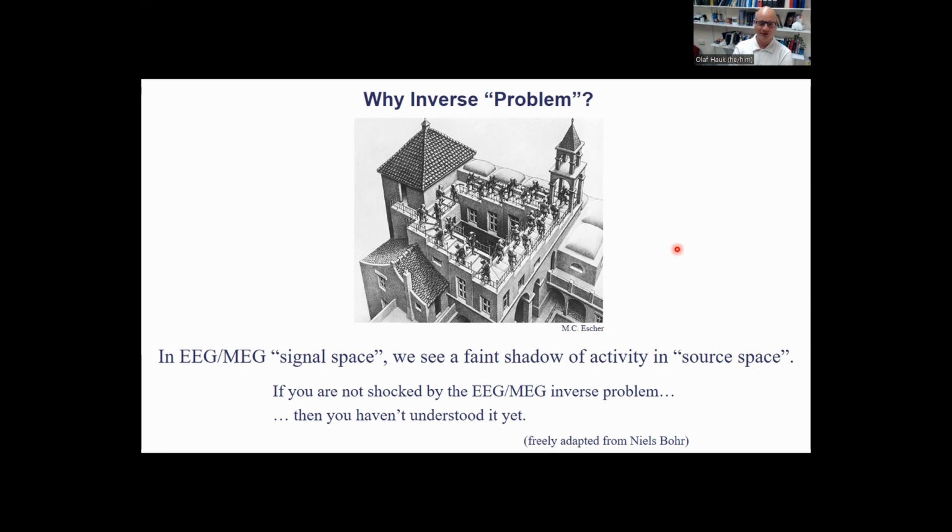Especially when you are starting to explore the zoo of different source estimation methods, there are simply some fundamental limits to our spatial resolution, to the information we can get from our data. And you either have to live with it or you have to find a way to get additional information from elsewhere. But there is simply no mathematics or clever algorithm that can get you information back that you've lost during the measurement.